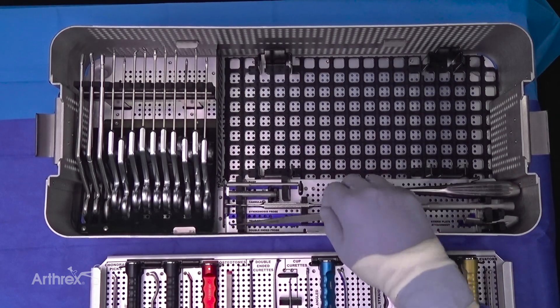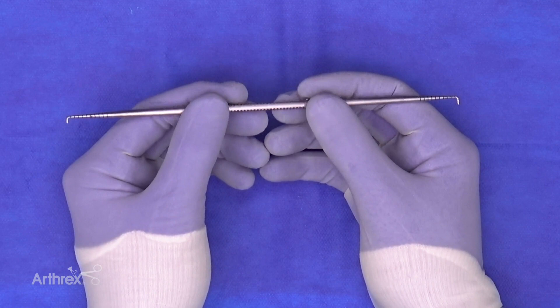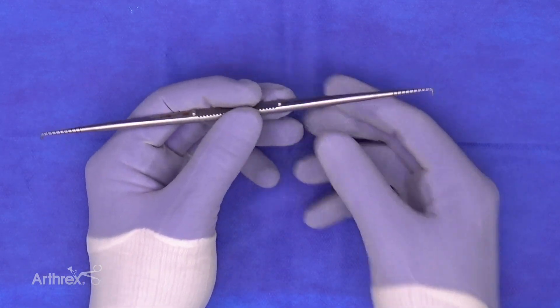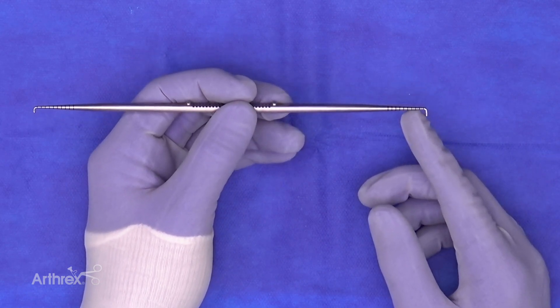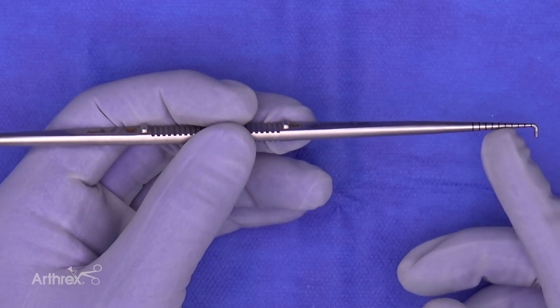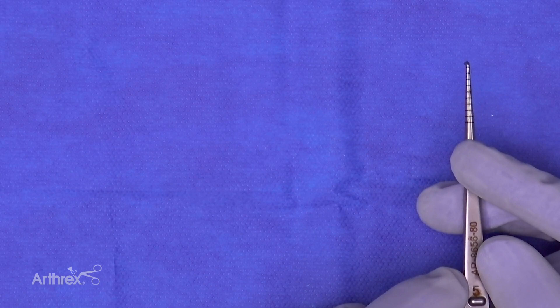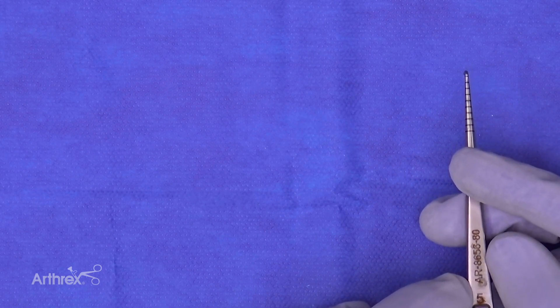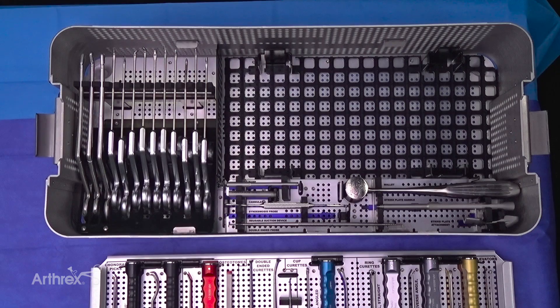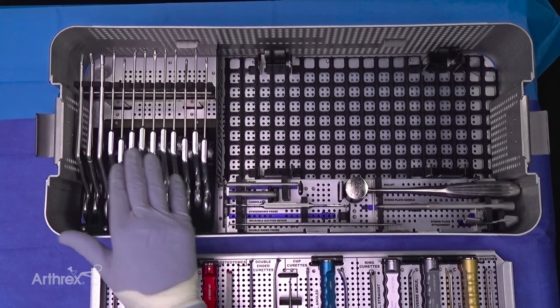Last but not least in this tier is our double-ended probe: a 4mm probe on one side and a 5mm probe on the other, graduated with 2mm increments. When assessing a cartilage defect, the surgeon can determine exact dimensions — for example, a 14mm by 18mm defect — and annotate that in their operative note.